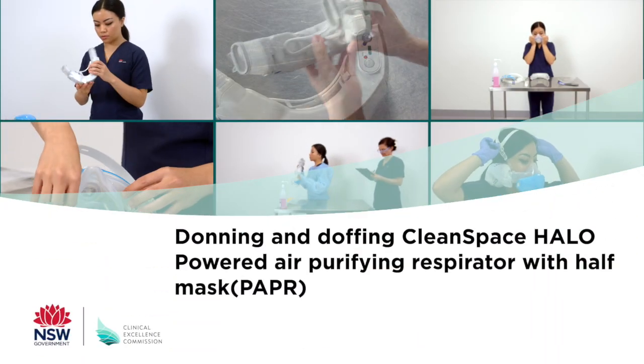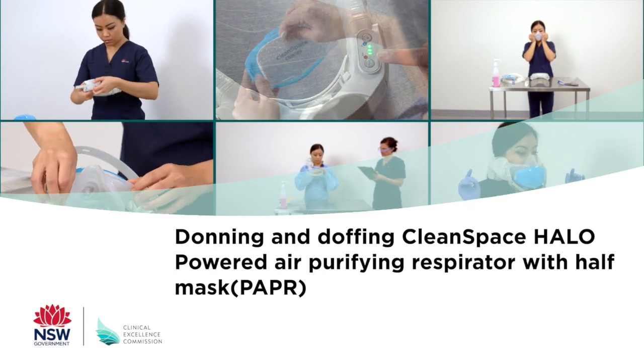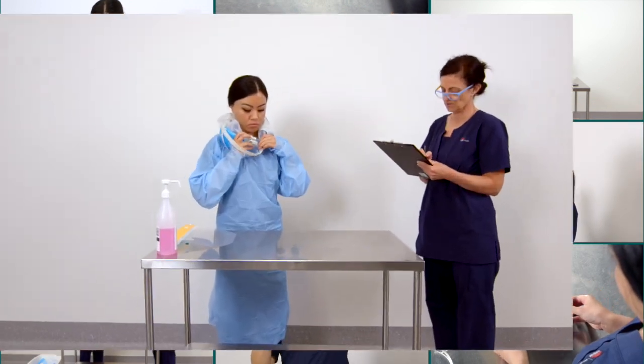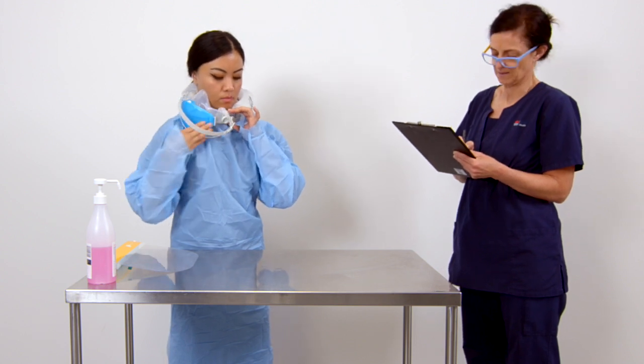This video outlines the steps for donning and doffing the CleanSpace Halo powered air purifying respirator, or PAPR, with half mask. It is recommended that the PAPR is donned and doffed using a buddy system with a trained observer using a checklist.